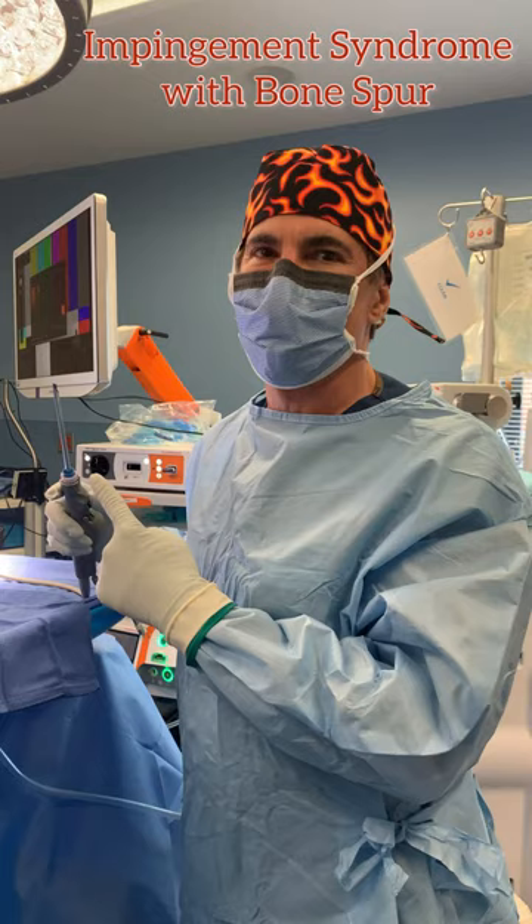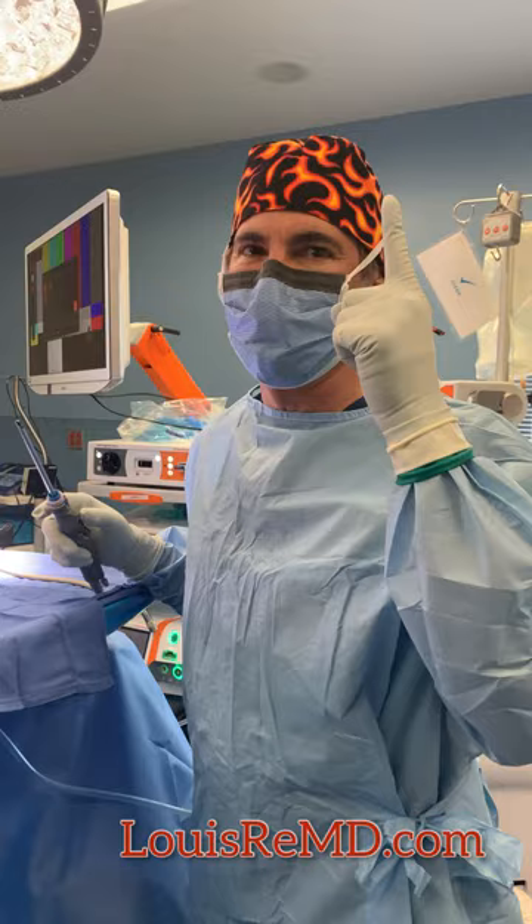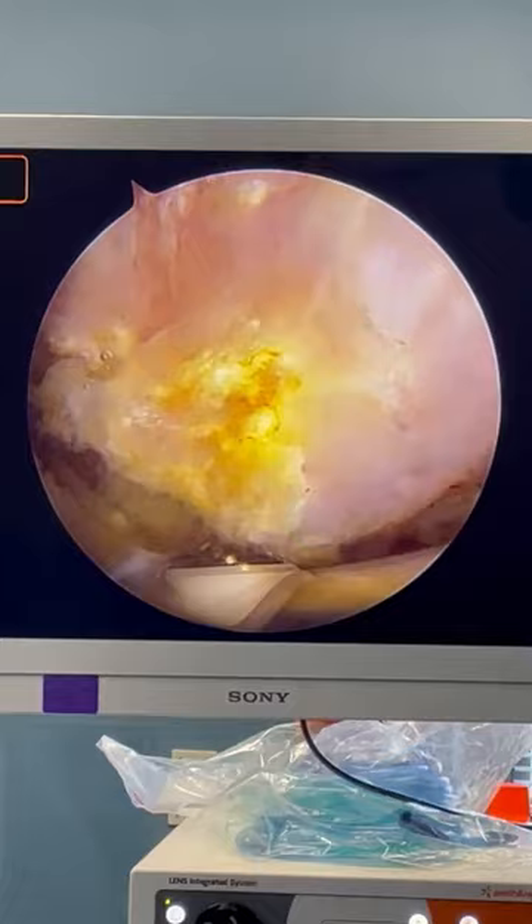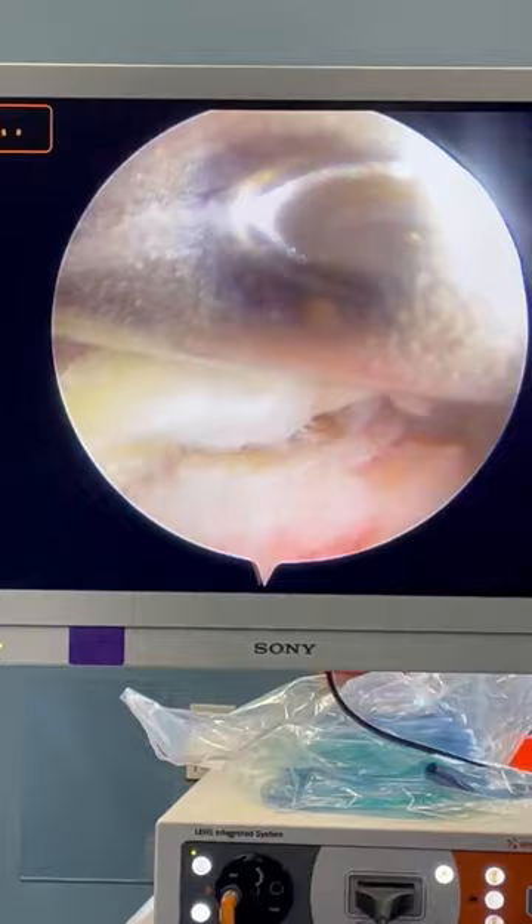We're going to use this burr-like device to remove some bone spurs from a patient's shoulder today. The bone above us is called the acromion — it's the roof of the shoulder. It has a pointed spur, which is a calcium deposit that develops with age on the front of it. This spur digs into the tendon below, causing rotator cuff tears.